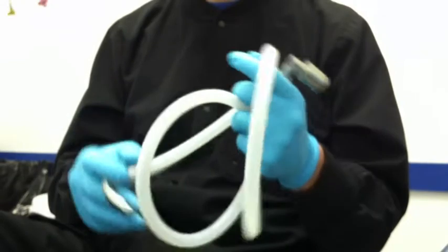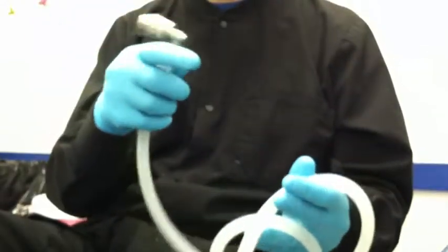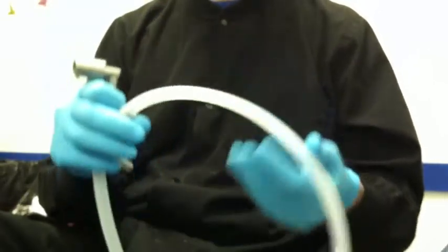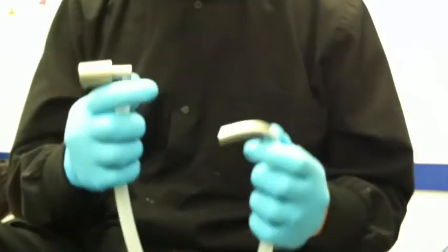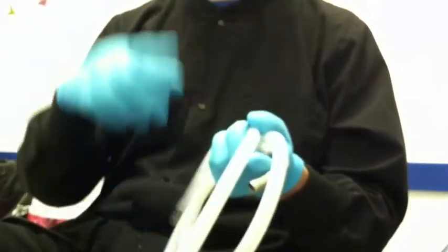The advantages of having the tube kit attached to the adapter is it's a little bit lighter. It hangs off the patient a little bit better and it makes the adapter a little bit quieter. And you'll see that in the video that I'll have after this.